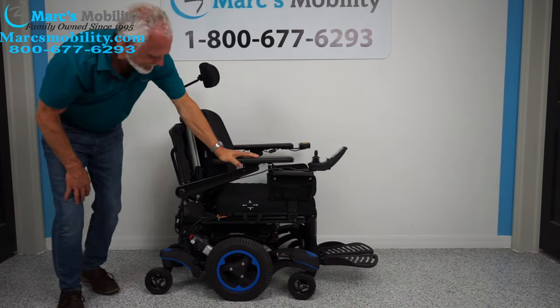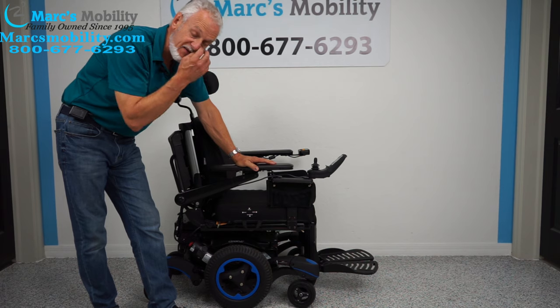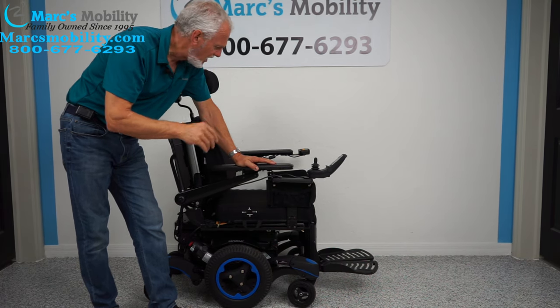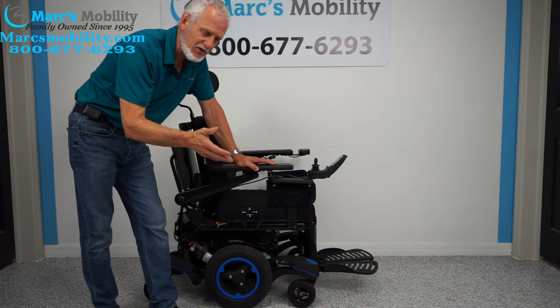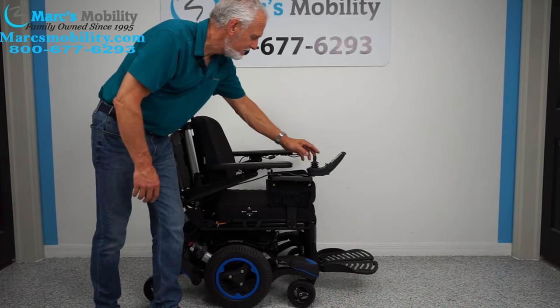This chair is built like a tank and has 107 miles on it, meaning it was used for about five months. If a person uses their chair every day, that's about 25 miles a month, so 107 miles equals roughly four or five months.